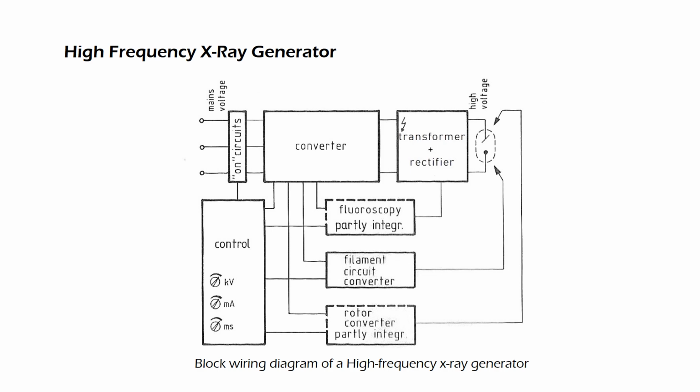The use of a converter brings about a significant change in the design of high-frequency X-ray machines. So, we will briefly discuss what a converter does and what the advantage of using this technology is in high-frequency X-ray machines.